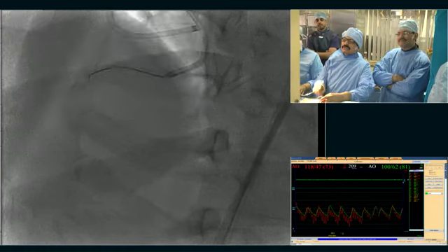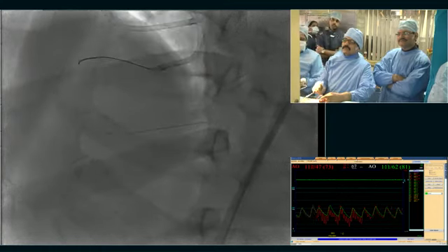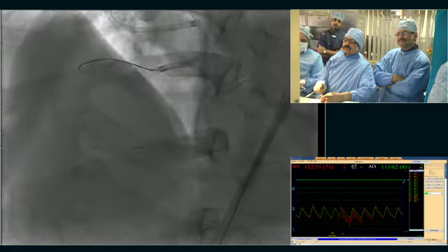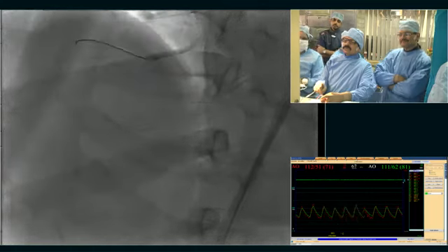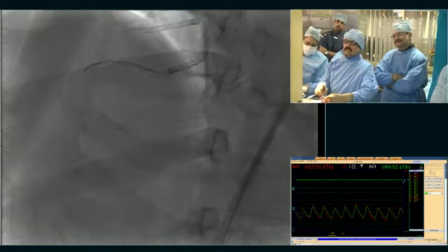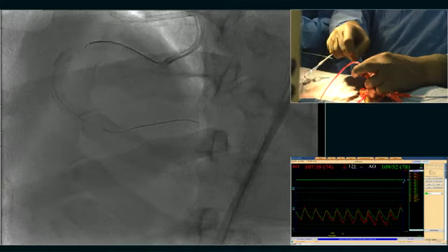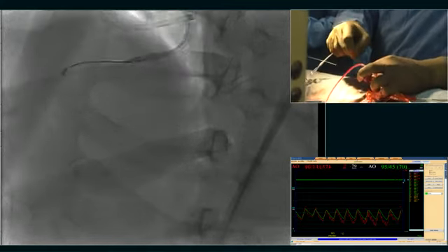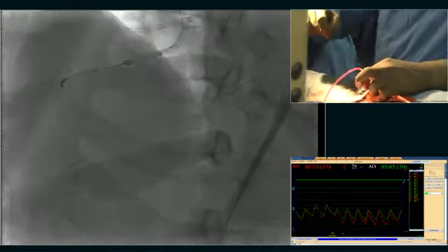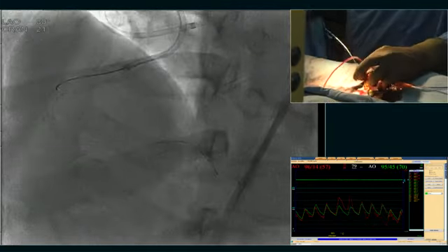But just inflate the balloon a little bit. This is another technique we use. Be careful, keep your gauge inflated at 3-4 atmospheres. Then I'll push the balloon. Sometimes that will work out. Difficult. It's a very hard calcific lesion, multiple layers of stents. The guiding catheter is coming over. I think if it is retrogradely filling, I'm happy with that.